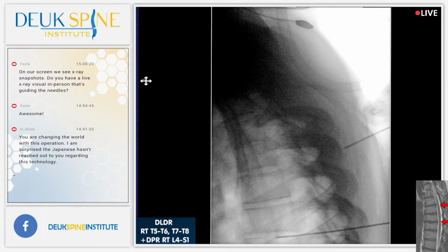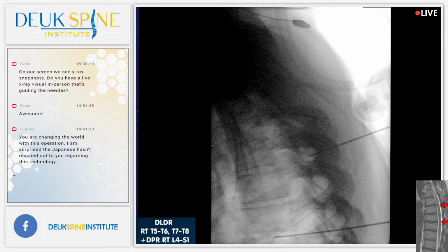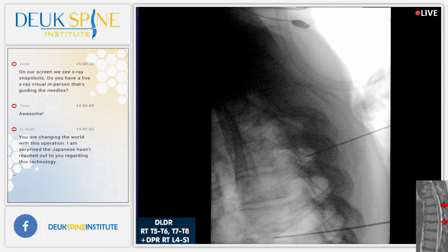Could just pull the skin up a little bit and see what we can do there. Shot? All right, that seems to be better. Remember, when I say shot, what I'm really doing is getting a picture. It's an X-ray image. And there's something just obstructing my path here.